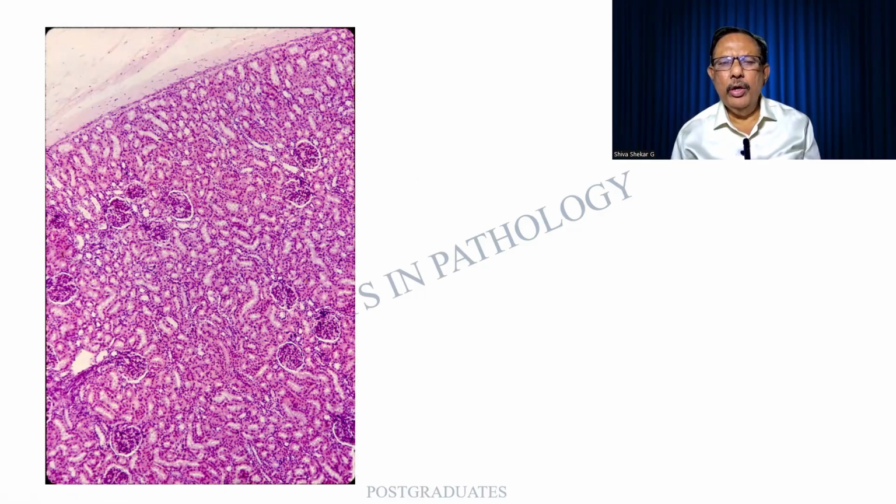Nevertheless, these are being separated by many tubular structures which are close. My professor used to call them back to back in arrangement. This can be disturbed in some conditions. So, the glomerulus and the renal tubules.